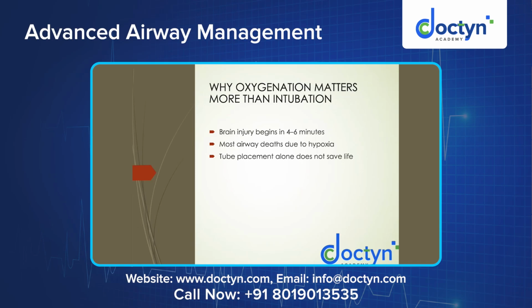It could be a difficult airway, a trauma airway, a normal airway, in the ICU or in the emergency. Our paramount goal should be to maintain oxygenation. Why is oxygenation most important? As we discussed, brain injury happens within 4 to 6 minutes because brain tissue does not have any oxygen reserves. Within 4 to 6 minutes of hypoxia, when lower oxygen concentrated blood is provided to the brain, apoptosis starts and brain cell death starts to occur.